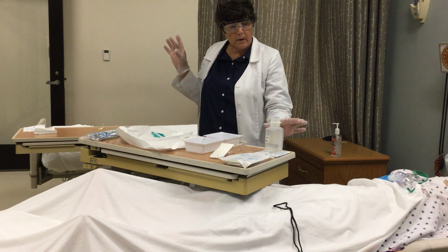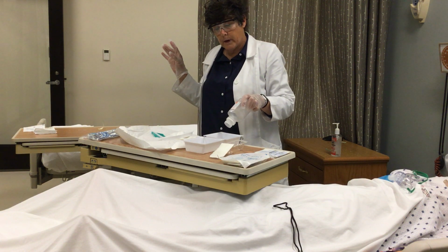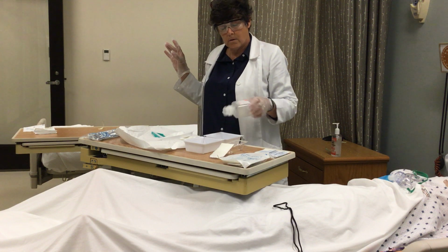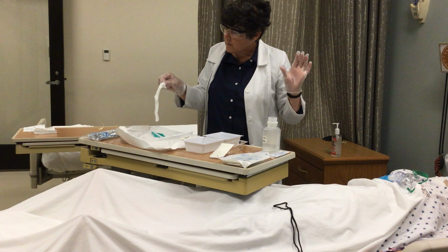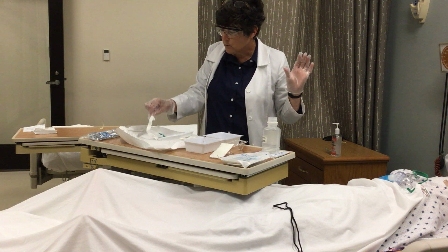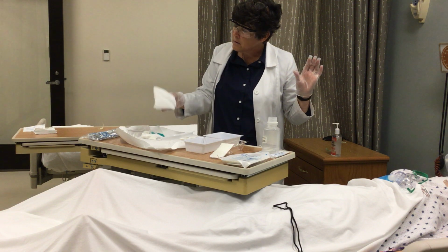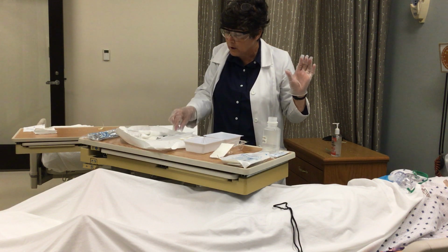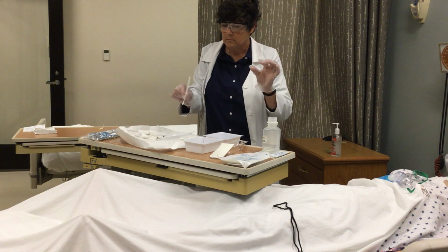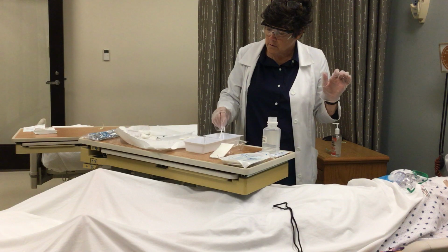And still with my dirty hand, I can pour some additional saline into a new basin that is still sterile. Included in this kit are some twill tape ties, which you can use instead of commercial ties, some gauze, a new drainage sponge, and 3 Q-tips. Those Q-tips go into your new saline.